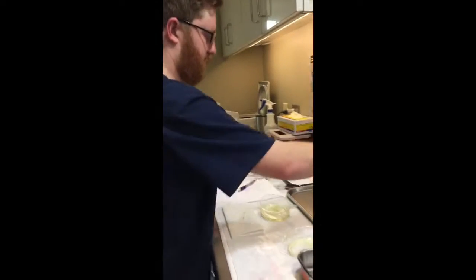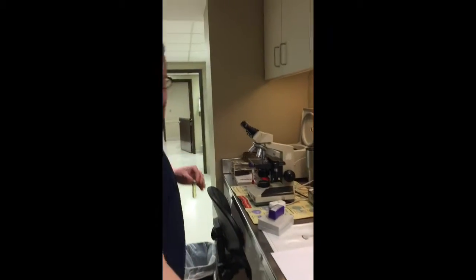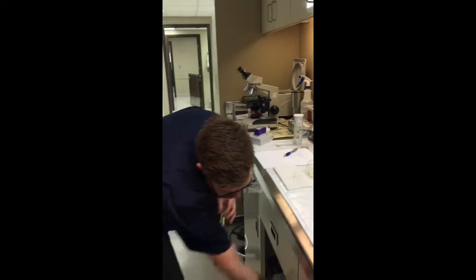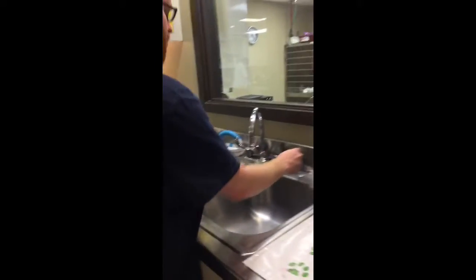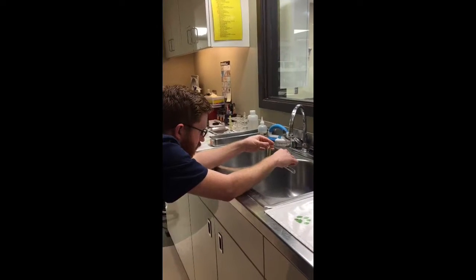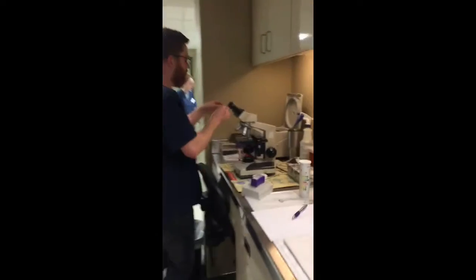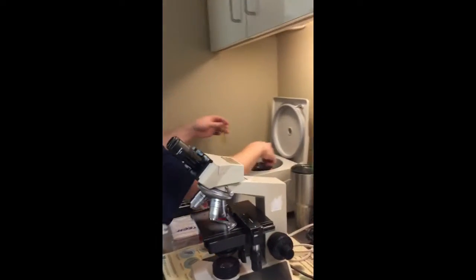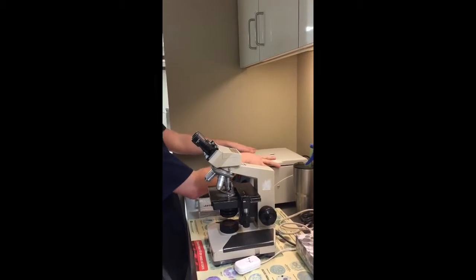Alright, and then I can take my sample and, let's see, get another tube to balance it in the centrifuge. I'm going to try to put the same amount of water as I have urine, and I'll take it over to a centrifuge and spin it for 5 minutes. And then we'll come back and see if there's any sediment here.